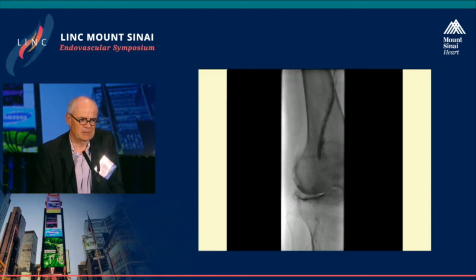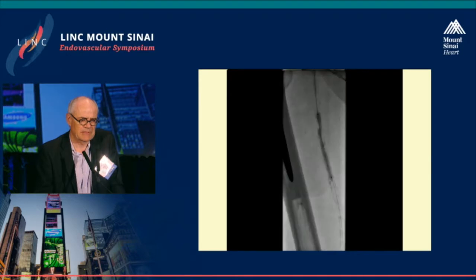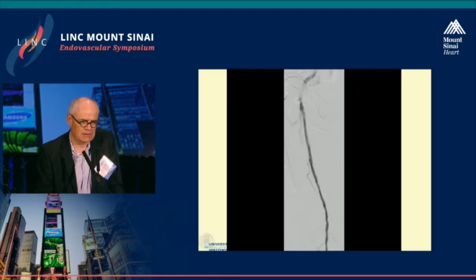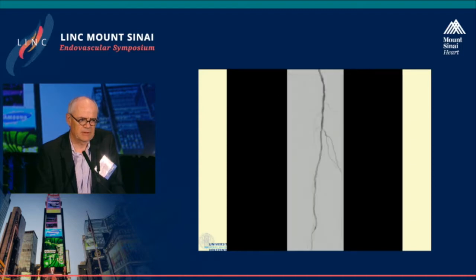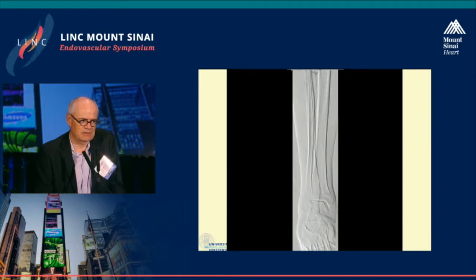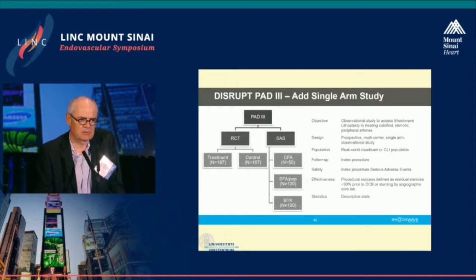So step by step, this was dilated with the shockwave balloon, followed by drug-coated balloon angioplasty, and ending up with this result, showing, I would say, an unexpectedly good outcome in this severely calcified vessel segment without the need of any scaffolding. At least the acute outcome before discharge was very promising, so there was no sign of residual stenosis.